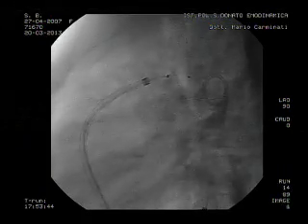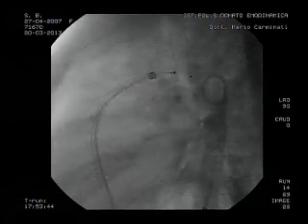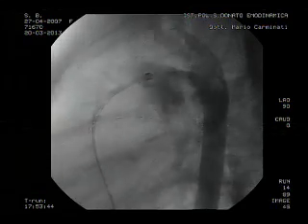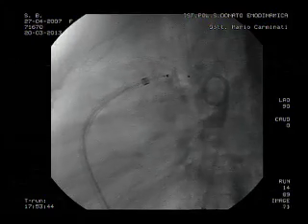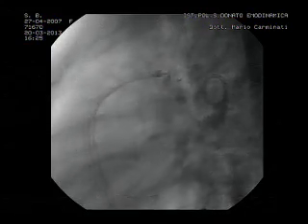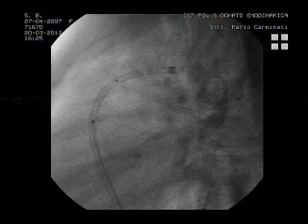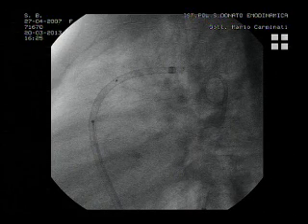Yeah. So Mario, is the duct bigger because there's a plug there, or because it's changing shape on its own? Well, I don't know. However, I see too much flow around it, and actually it slips through very, very easily. Yeah. And that's what Joe said would happen. Yeah, that's right. So this attempt failed, obviously.